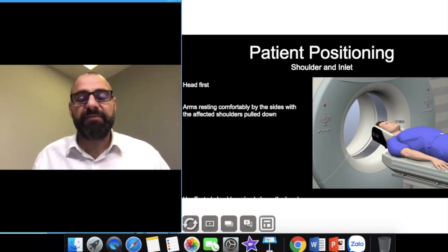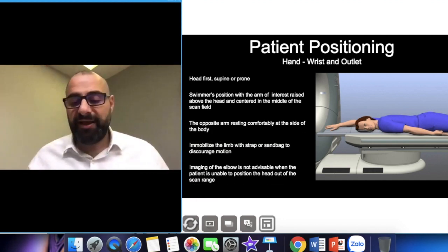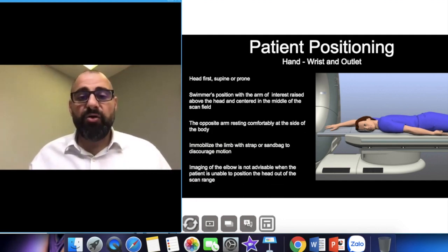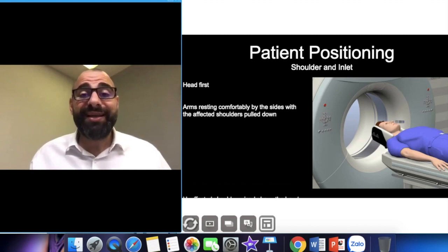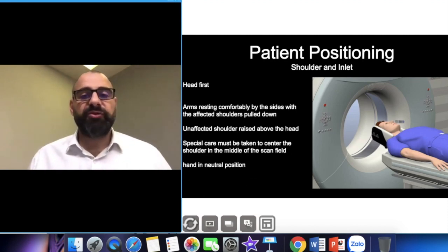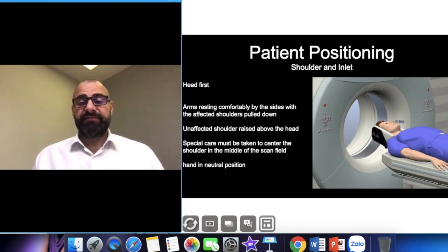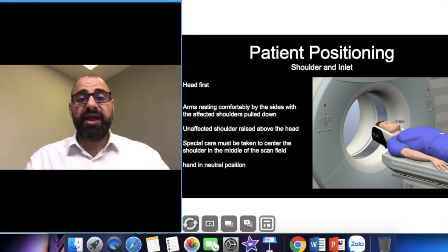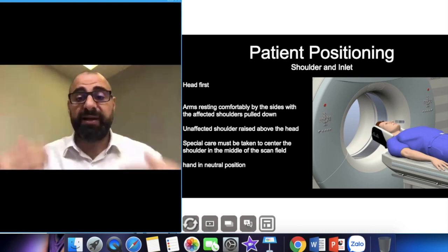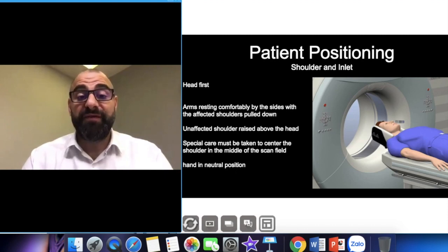Make sure the patient is head-first and prone, with the arm in the center of the machine — not the patient, because the arm is on the periphery. Also, if you're doing shoulder inlet or outlet imaging, put the patient in the head holder with arms completely by their side and the palm facing up. In this image you see the palm facing down — we actually want it to face up.